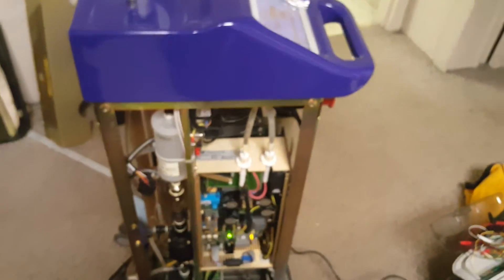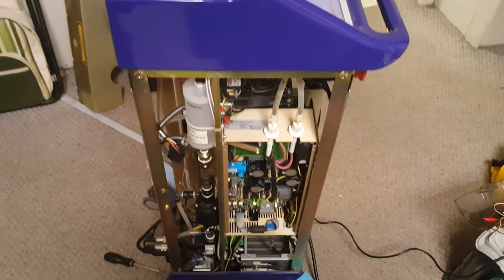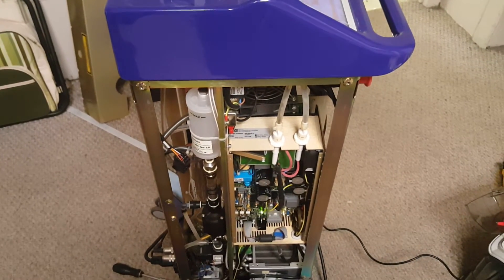I've tested the power supply separately from the laser and actually got the power supply to post correctly, so it seems the power supply is good. Which means the only thing really left, in my opinion, is that the laser tube needs to be re-gassed.